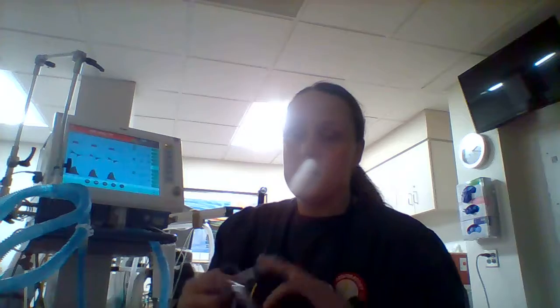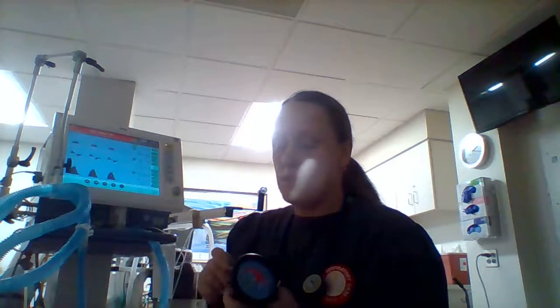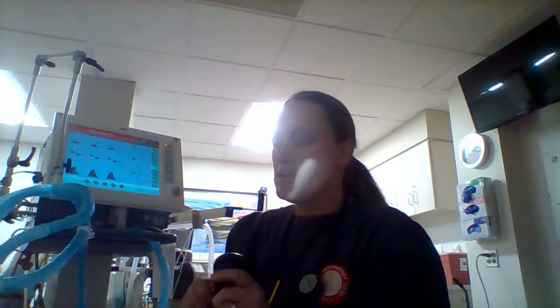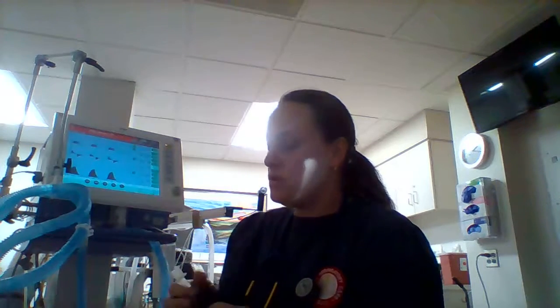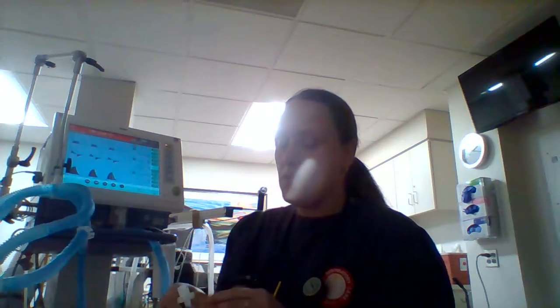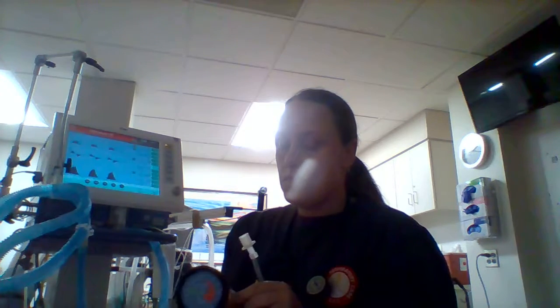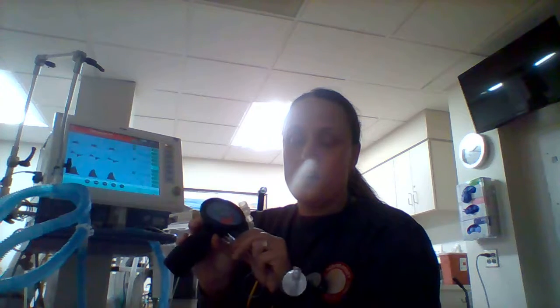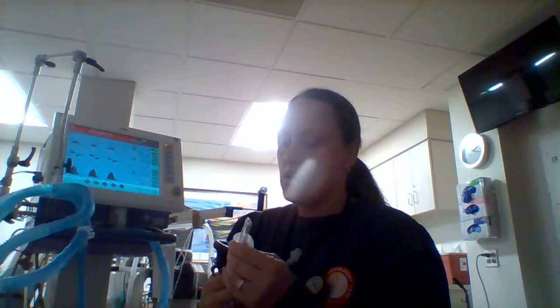This is my favorite part. So you're checking the pressure of that little cuff right there. You can take your pilot balloon, which I blanked on that word last time. Fantastic. Got right around 22. That will work. If I'm going to let some air out, I can push on the red button. And I can feel my pilot balloon going soft, but I don't really see my cuff getting softer.